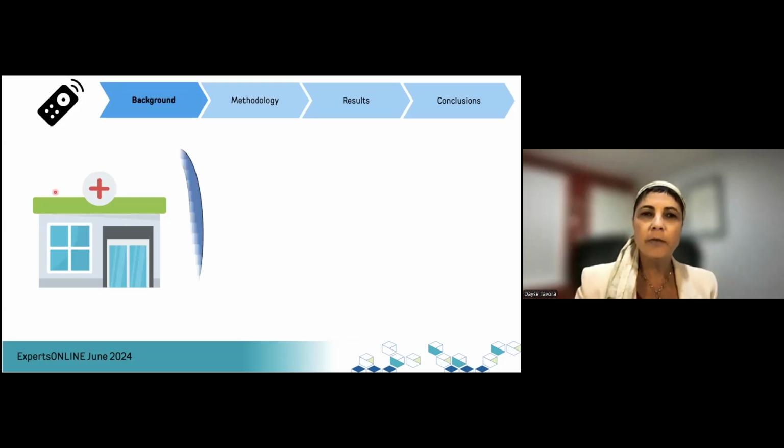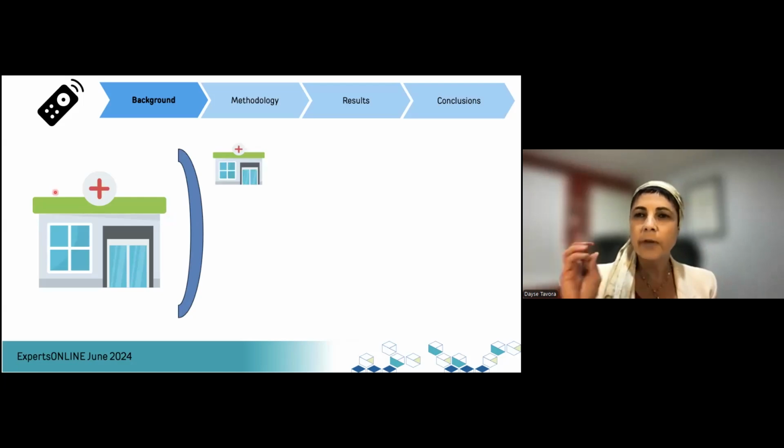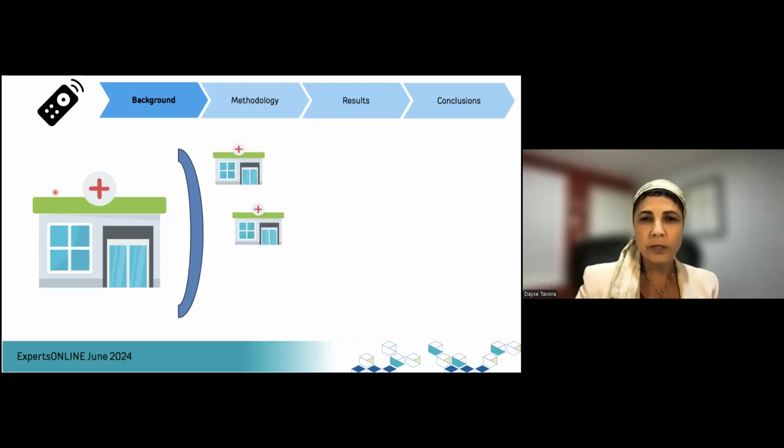And what we have across the state is mostly what we call telehealth centers. So when we have a patient who does not want to come to Perth, or for whatever reason they cannot come, we send the MAX box to that place, and we have several of them across the state.